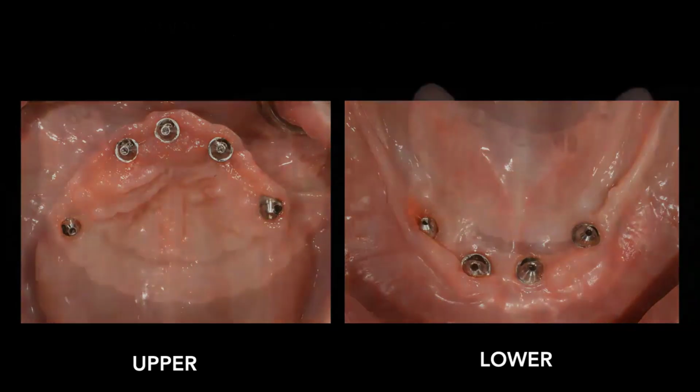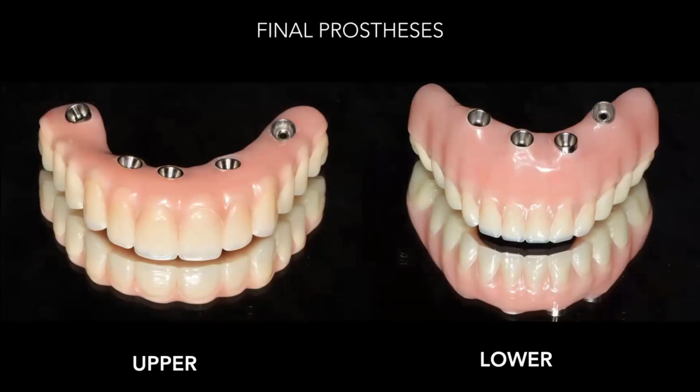And then we take impressions and we make these final prostheses. Now, these prostheses, I like showing this photo all the time. These are hybrids or bridges. And the reason why I like showing these is because you can tell how the underside of them is flat, convex, and smooth. It allows you to make sure that the restorations are stable, and also make sure the tissues are stable and healthy. And it's really important to understand that.